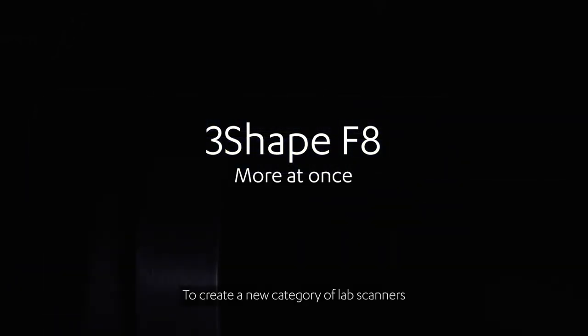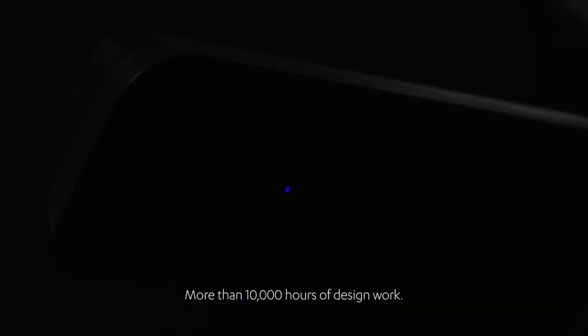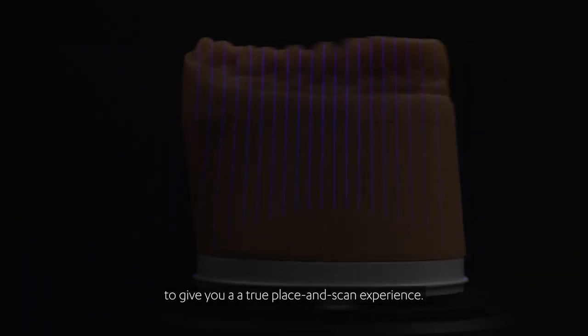To create a new category of lab scanners, we let function inform shape. More than 10,000 hours of design work. Today we lift the lid on conventional design to give you a true place and scan experience.